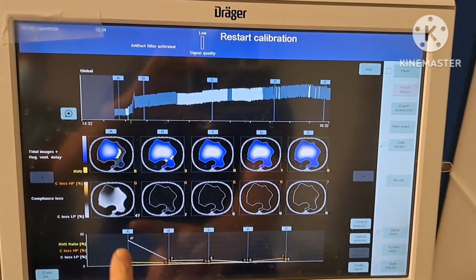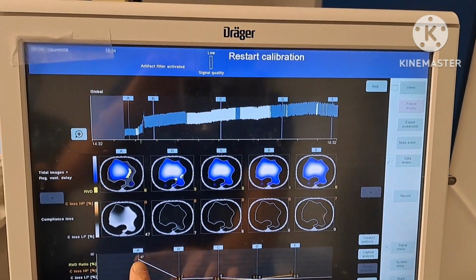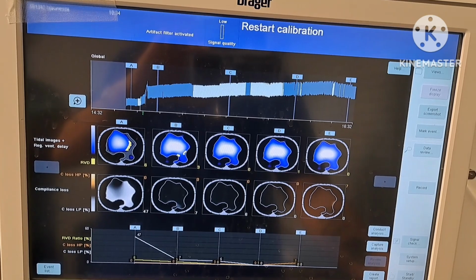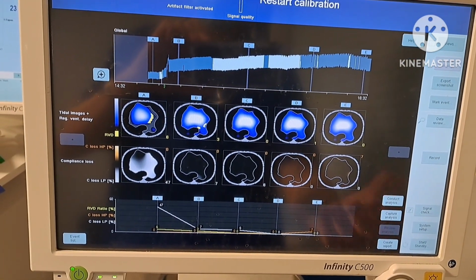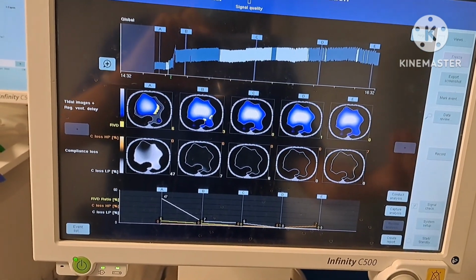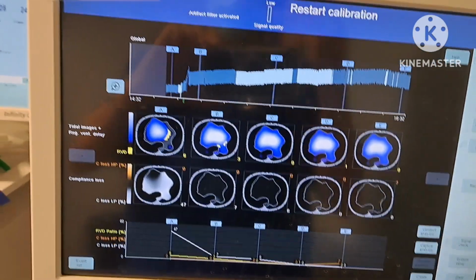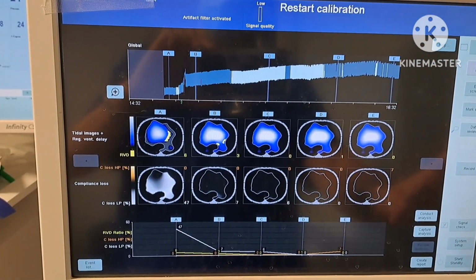Again, we're looking at the transition between the PEEP of 10 when we were on pressure support, where the tidal volumes were 10 to 8 mLs per kilogram, but half the lung was not taking part in ventilation. So it's like, sure, the FiO2 is 50%, the tidal volumes are not too bad, but we had no idea before putting this on that there was total de-recruitment.